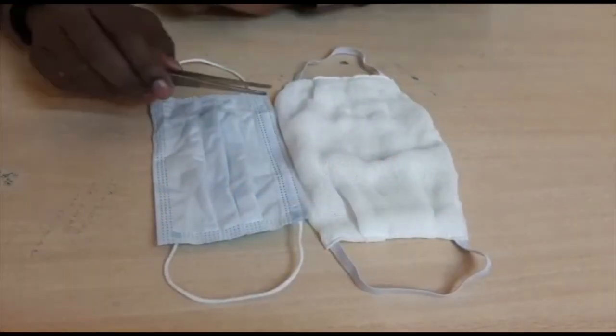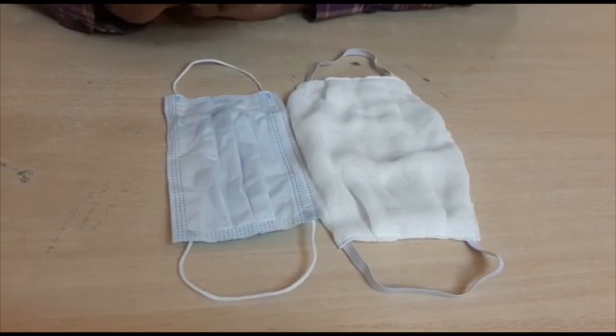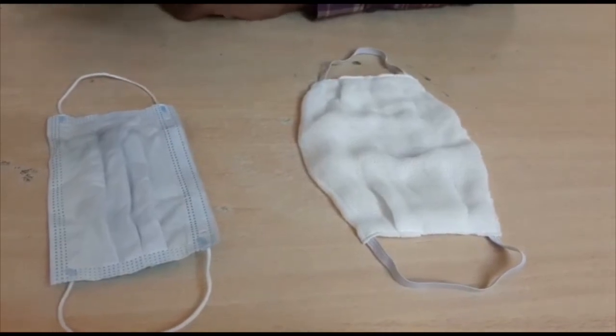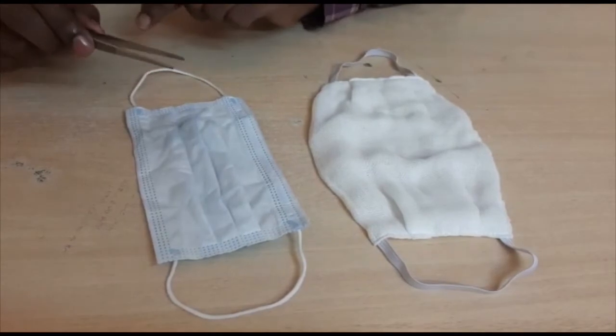As you can see, we have different types of masks. This is a medical mask and this is not a medical mask. We are going to talk about the medical mask.